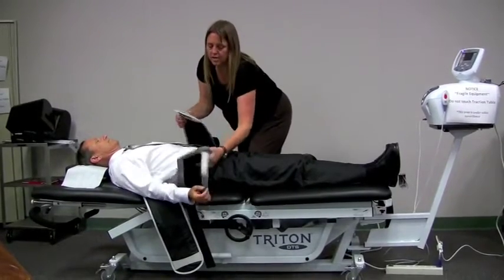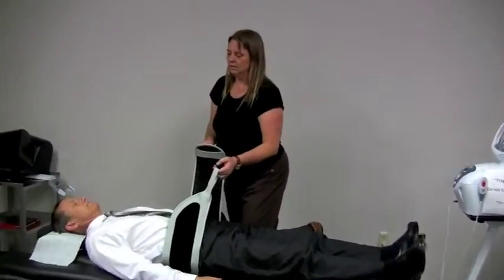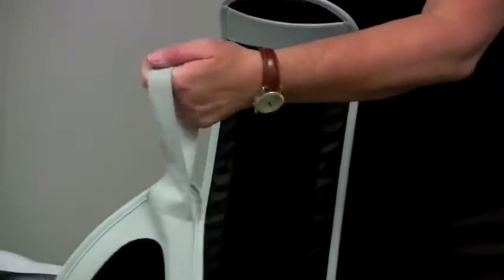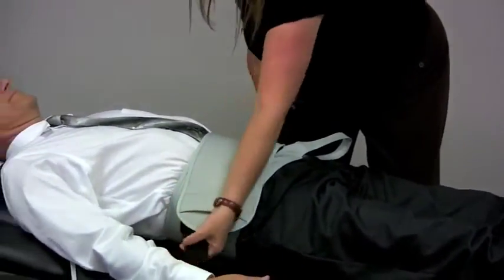Now, to tighten this, you should be sure to ask your patient if they've emptied their bladder. So hopefully it's not uncomfortable because it will compress a little bit. And I pull down and across. Does that feel snug? Yes. It's like above your hips there.